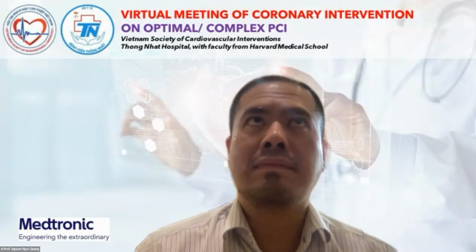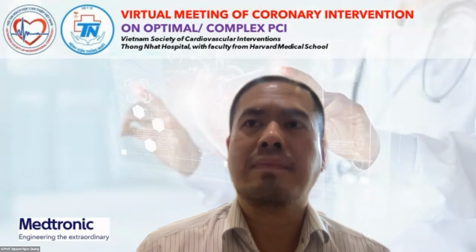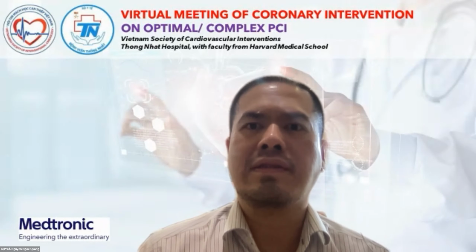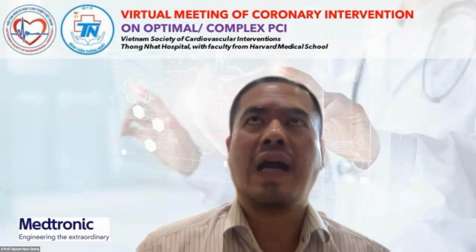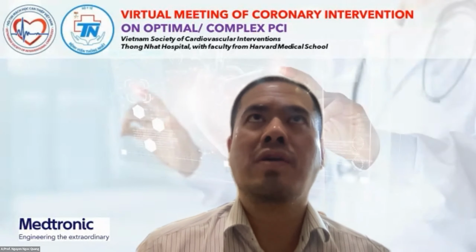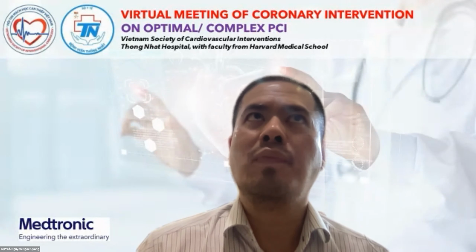I think that based on the new SCAI classification of cardiogenic shock, we might think about putting the support in an early phase, before the patient really becomes cardiogenic shock, and then we can save the life and also save cost. IABP might be very good in a very early phase, because if the LV dysfunction is very severe, then the IABP is not very useful.